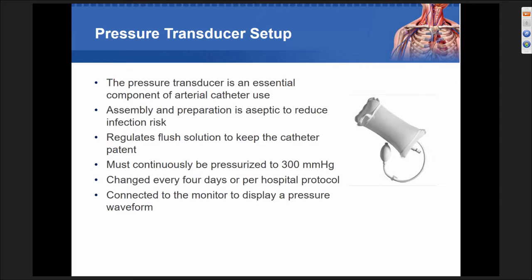Is it made for you? Do you burp your bag to make sure there's no air in that setup? And who does the sterile connection when that arterial catheter is placed in your patient? Is it you, or is it somebody that puts their hand into your field and attaches that setup for you?